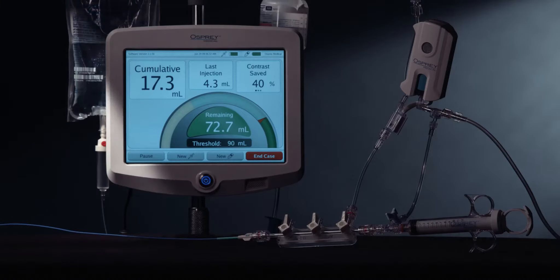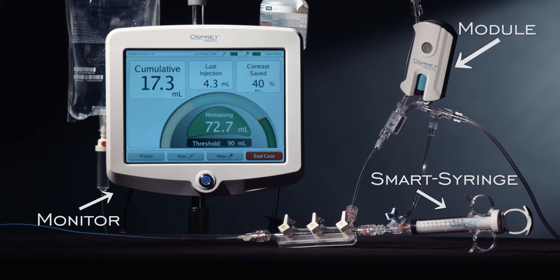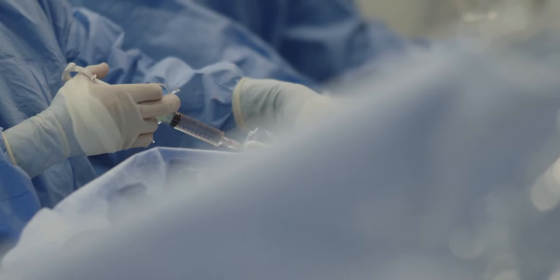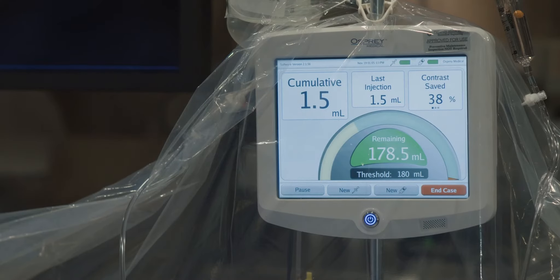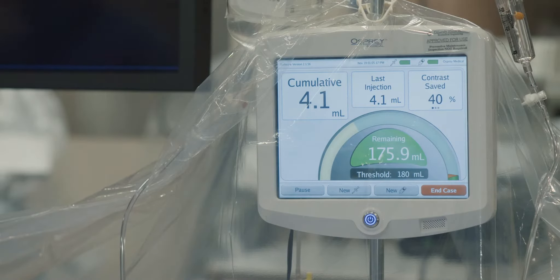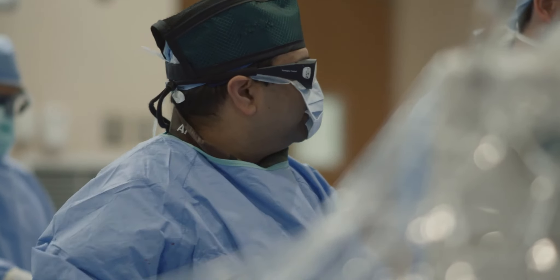Divert Plus Easy combines proprietary contrast reduction technology with real-time contrast dose monitoring. Bluetooth technology incorporated into the disposable module and smart syringe allows for wireless communication with the monitor, automatically displaying real-time information upon each injection of contrast dye.